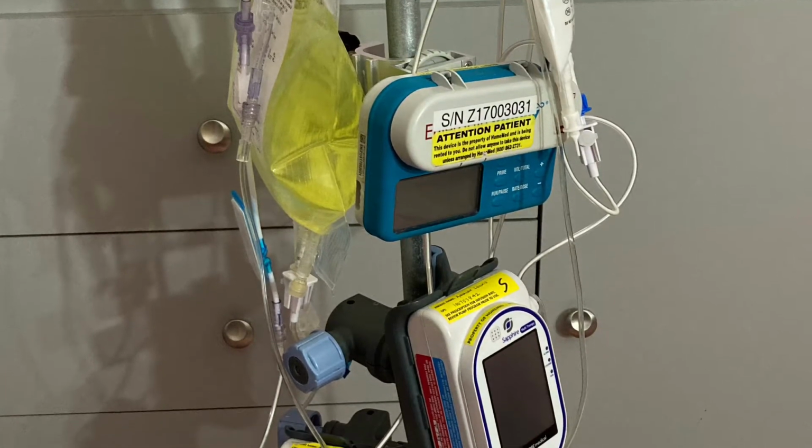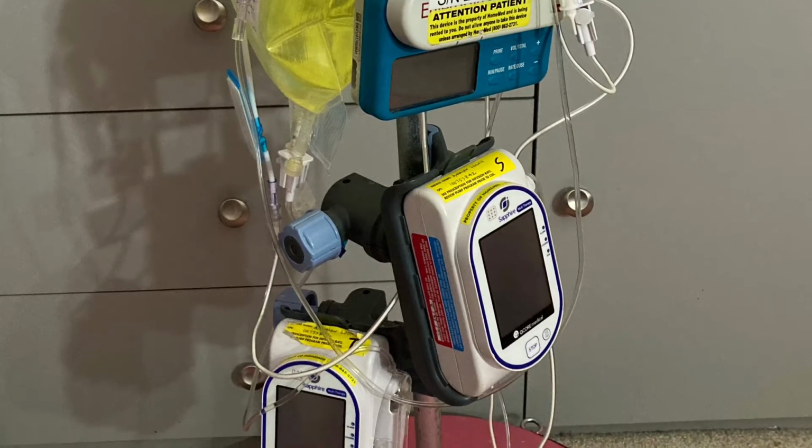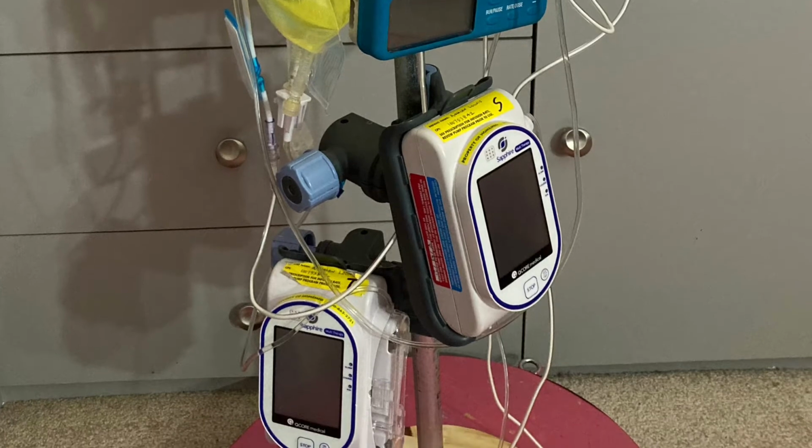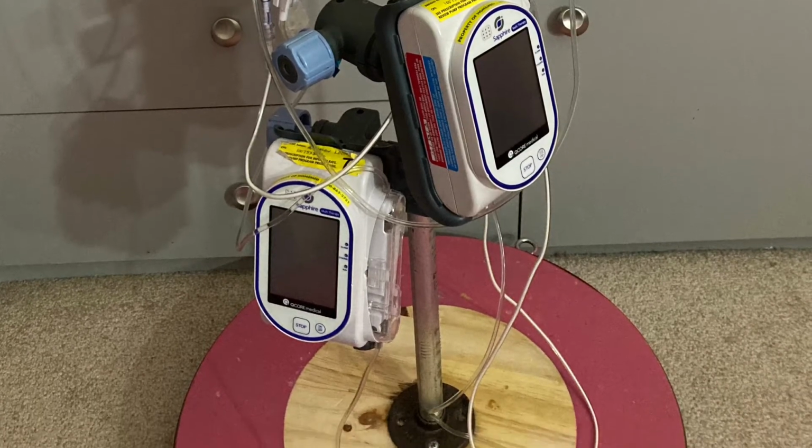This can be mixed up to 10 hours before you actually connect her. This is because her cycle currently runs 14 hours, which equals 24 hours. TPN has to be done infusing 24 hours after it's mixed.